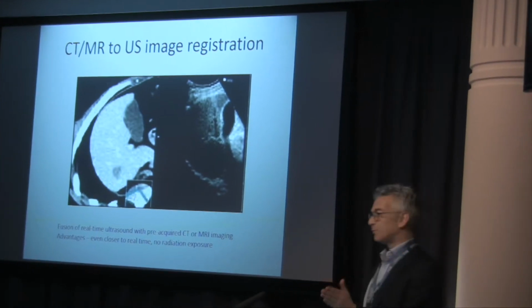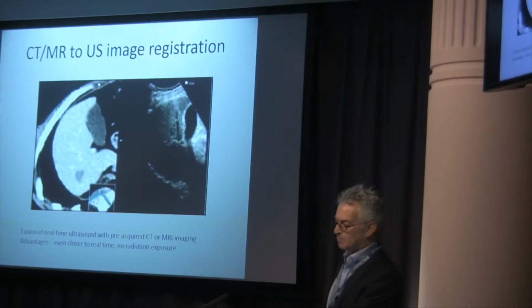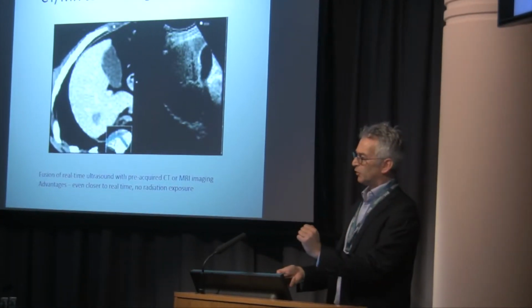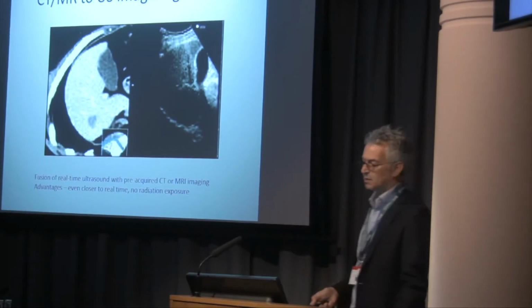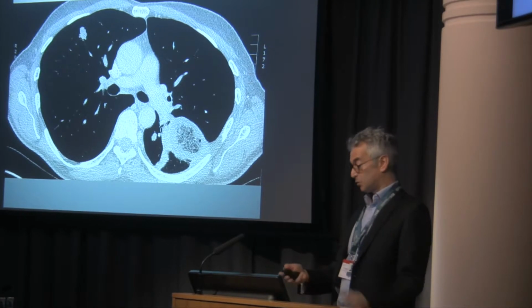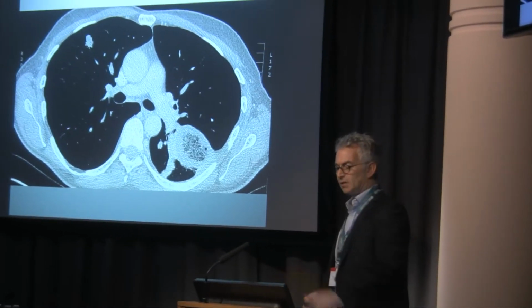And similarly, using the best of ultrasound with the enhanced CT. The trouble with CT is fantastic visual acuity, but the best results are seen with enhancement, and of course that's not happening while you're in the scanning. You just see the greyness. You lose the soft tissue definition. But CT is fabulous where there is natural soft tissue definition, such as in the lungs.